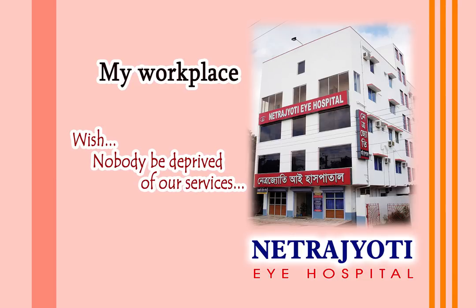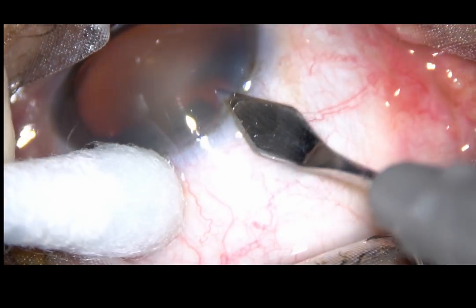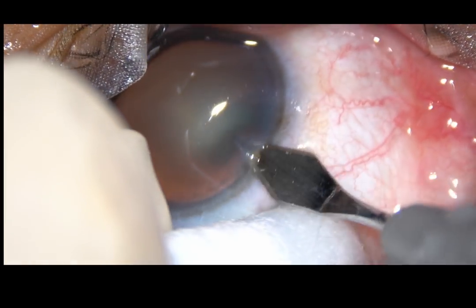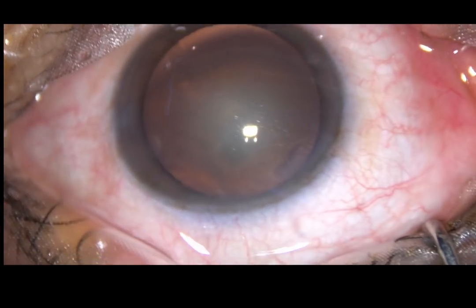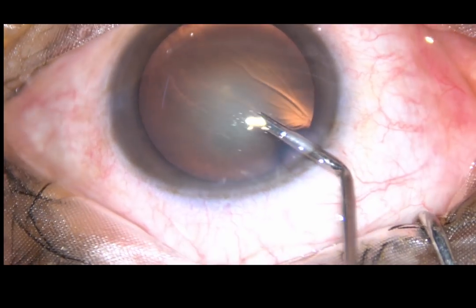Friends, welcome to my hospital at Rana Ghat, India. In this video, I am going to show the carousel or cartwheel technique of phacoemulsification in a soft cataract. By this time, the main incision has been placed at around 11 o'clock.